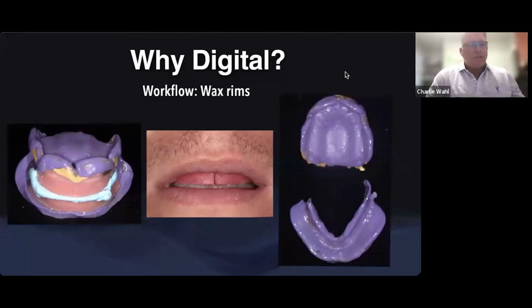And then very rarely our patients come into our practice with no teeth at all. It's definitely not the norm, but every now and then they do, whether they lost dentures or, over time, never had dentures and are finally in a position to get teeth. But this is the same exact concept, right?